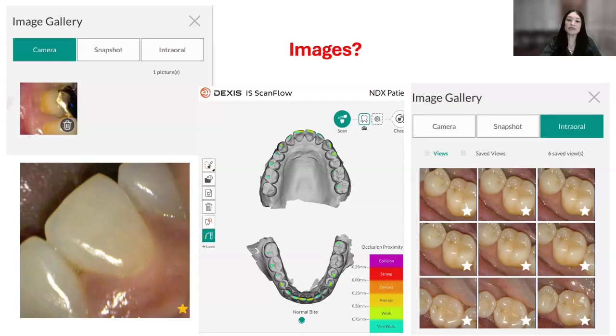The second one is a snapshot button. And what does that do for us? Just think about when I'm using my cell phone and I screenshot my screen. Same thing, we just screenshot what was on the screen.